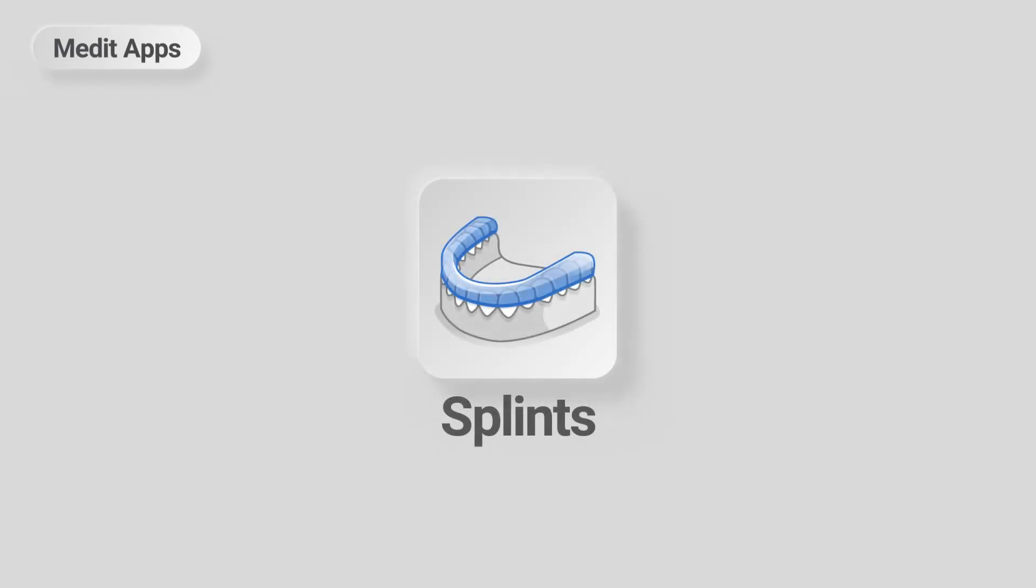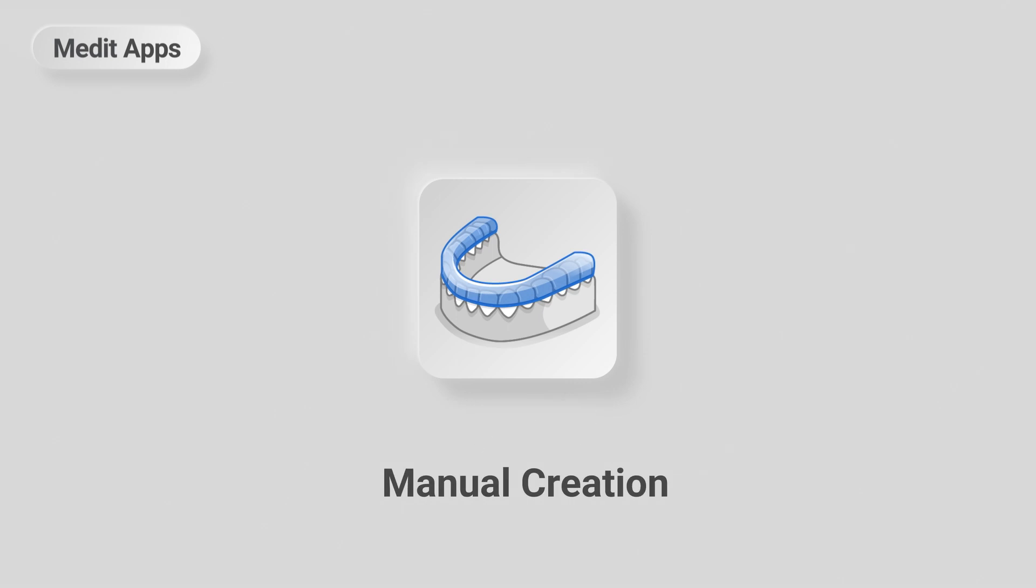This is a quick guide on how to create splints using manual creation in Medit's splints app. Let's start with the app installation.